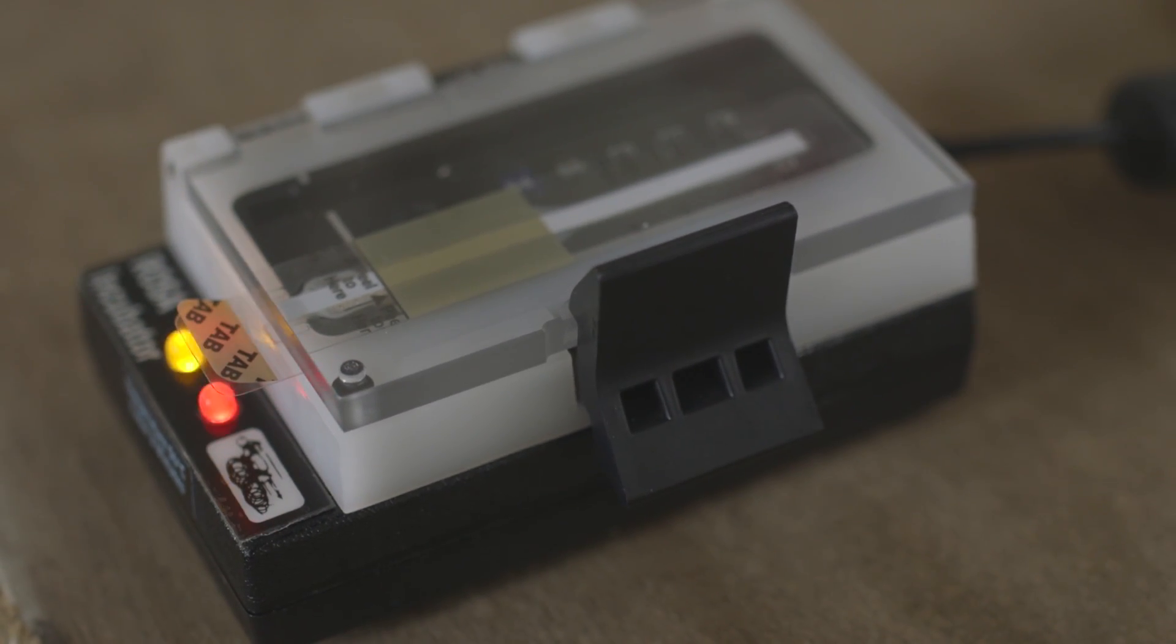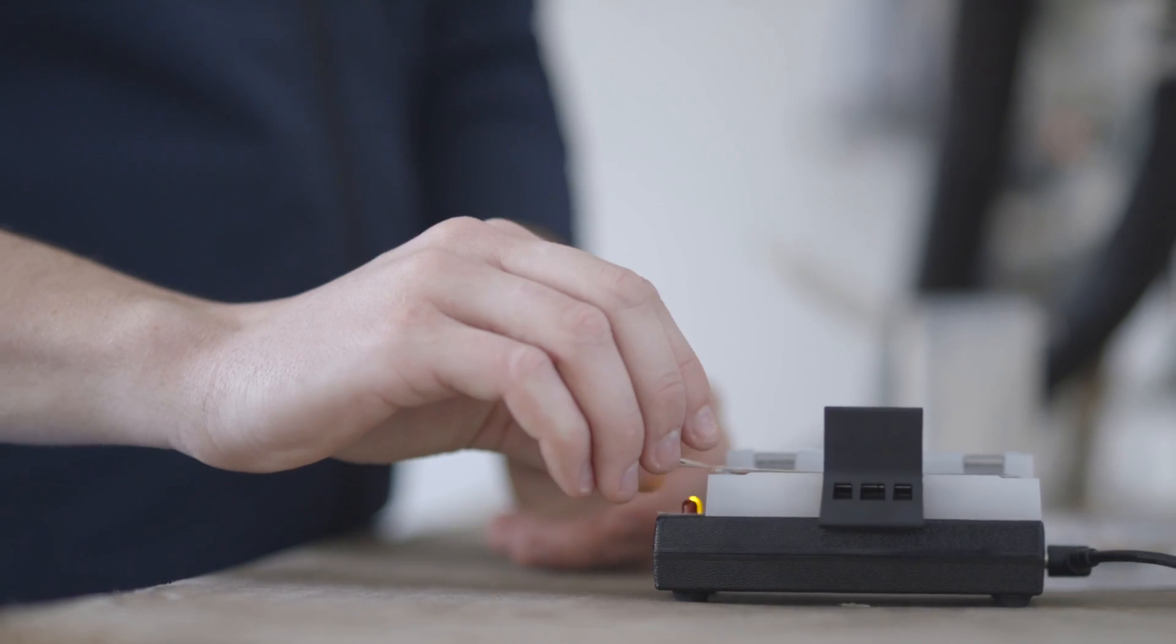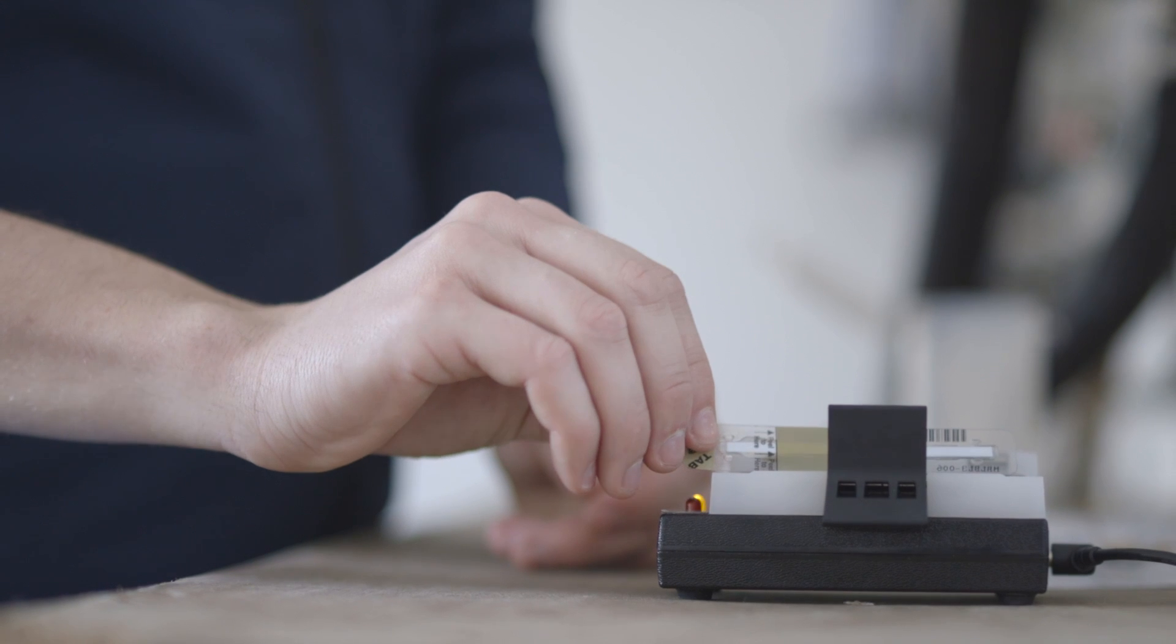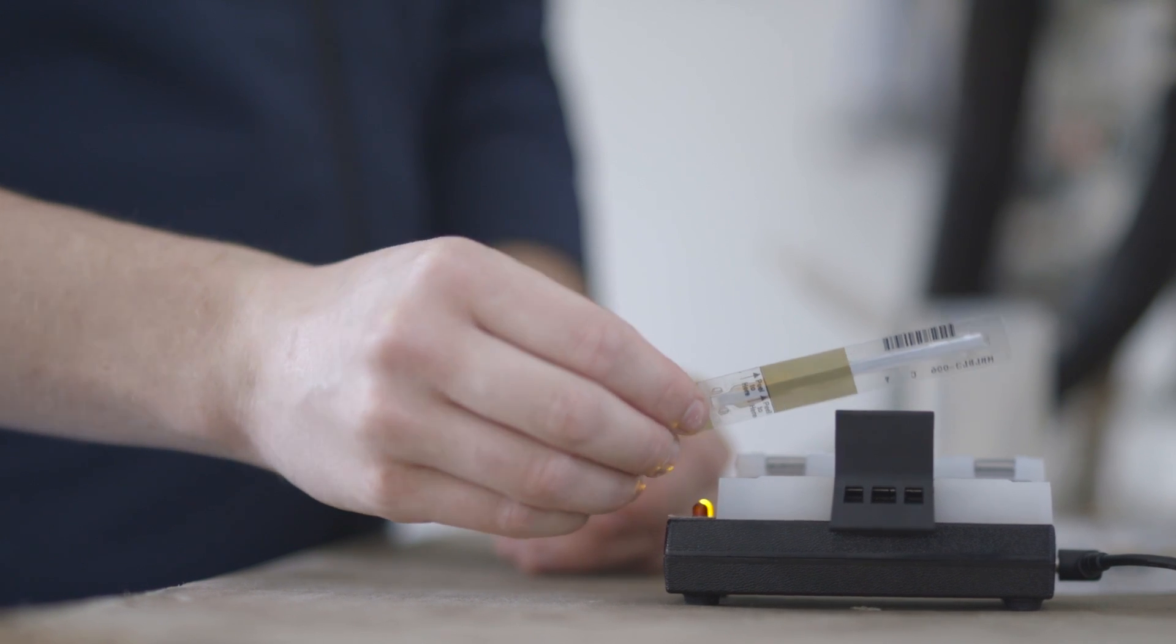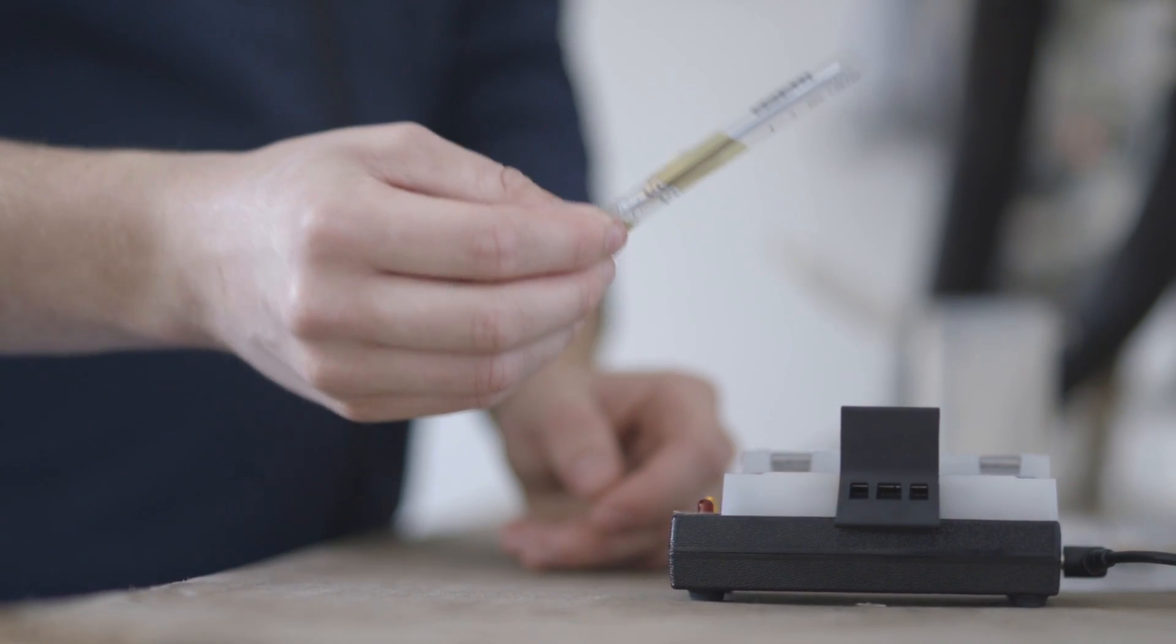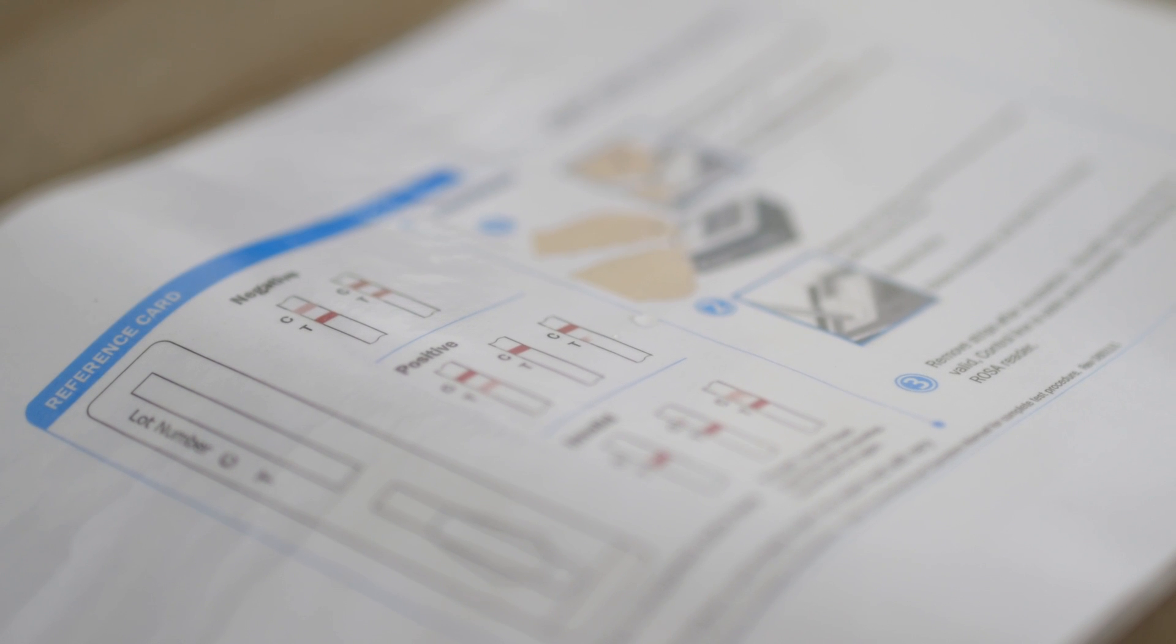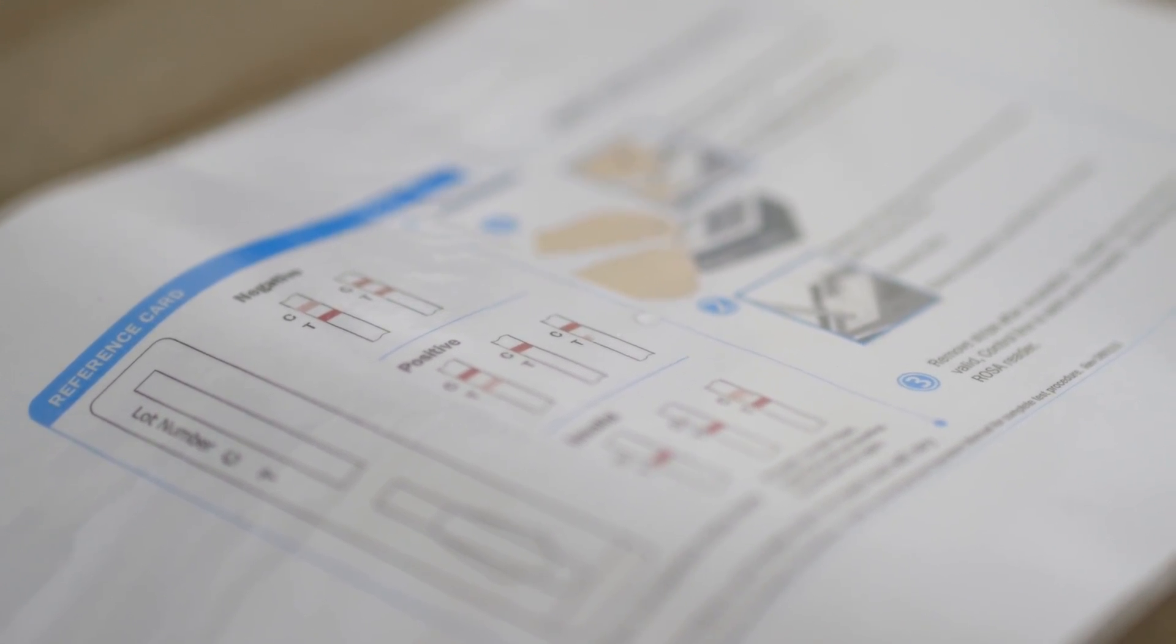Once our strip is incubated, we then remove it from the incubator and visually assess whether the milk is positive or negative. We use our visual reference guide to assess whether the strip is positive or negative.